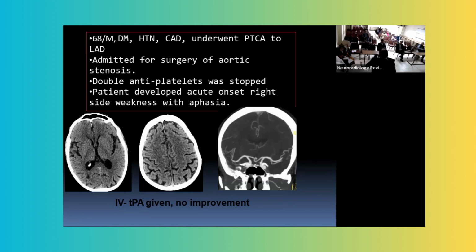We do CT brain non-contrast with CT angio, because it saves time, and because CT perfusion is not available in most of the centers in Pakistan, I rely on the MRI: DW, ADC, FLAIR and T1 images. With CT non-contrast, I rule out brain hemorrhage. With CT angio, I know the site of the occlusion, and with MRI, I see how much salvageable brain is available.